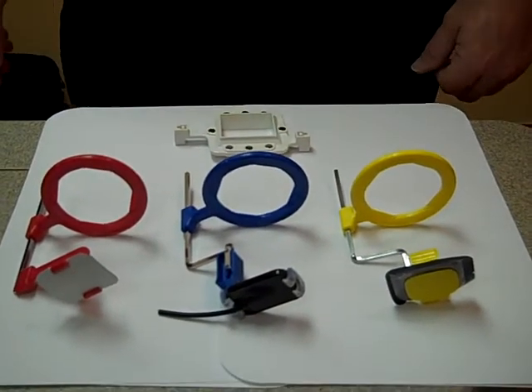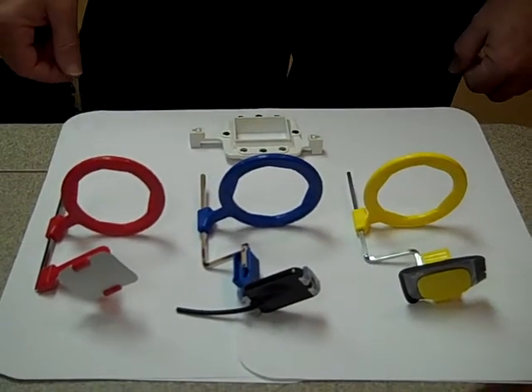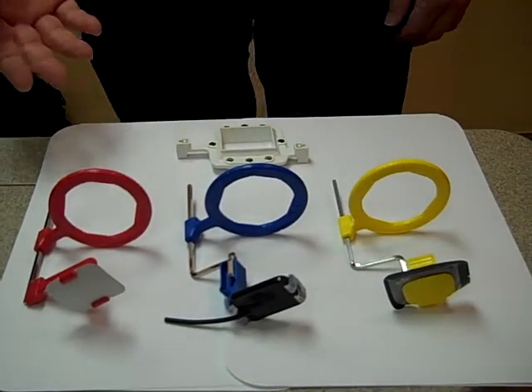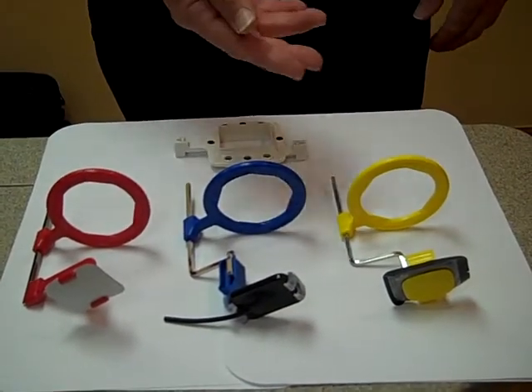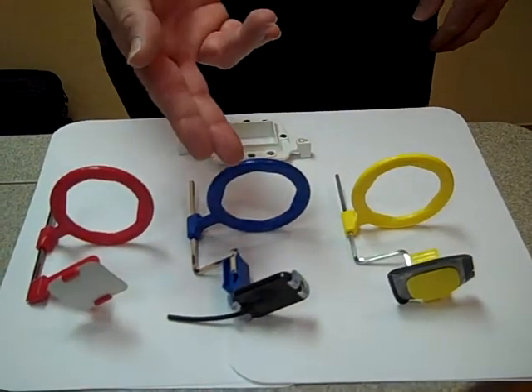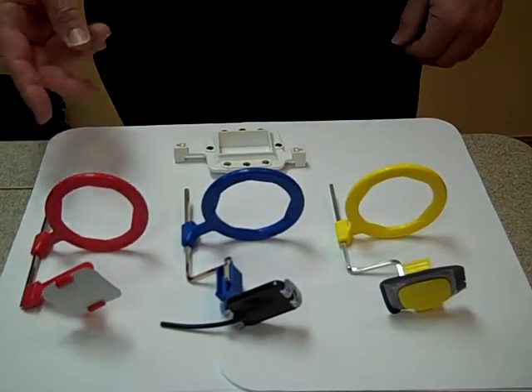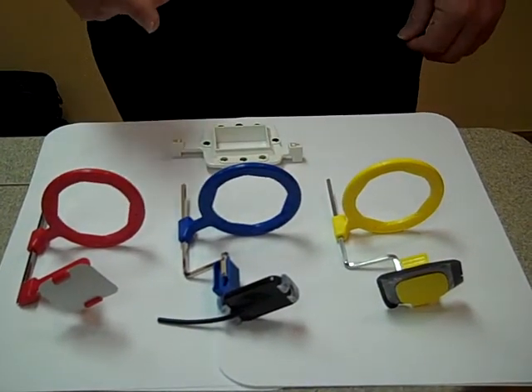What I'd like to do now is show you how you can use the TrueAlign with your current RIN positioning devices. As you see here, we have your standard RIN setups with a phosphorous plate, a digital sensor, and a piece of film. You will use the same technique and the same RIN instruments with one exception.